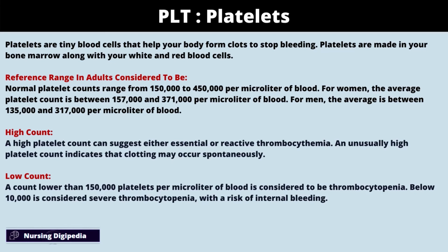For women, the average platelet count is between 157,000 and 371,000 per microliter of blood. For men, the average is between 135,000 and 317,000 per microliter of blood.